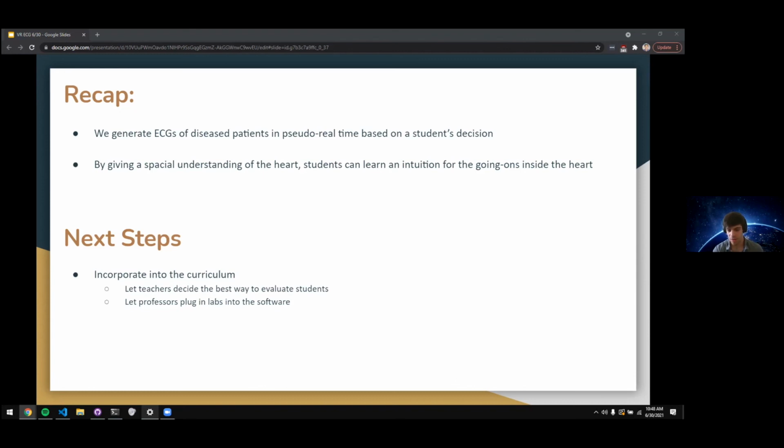And so ultimately the evaluations will probably be something like, what do you think the profile of the patient is based off the ECG that we're generating? And so we should have data from heavy-set people, thin, big, small, all types of body profiles. They'll just be inputted as 12-lead data sets rather than reflected in the actual person in the body, if that makes sense.